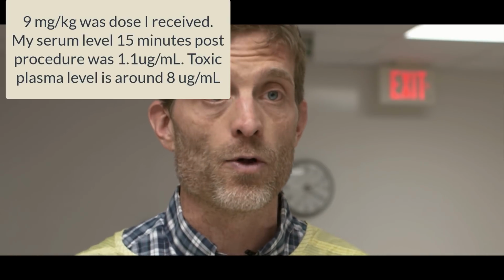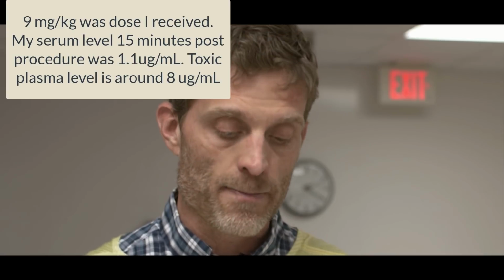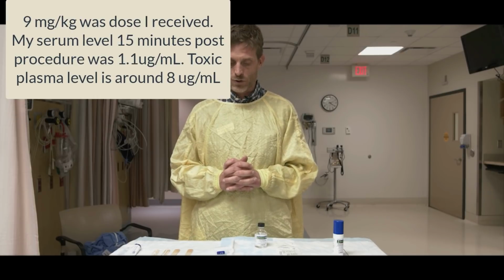But my total lidocaine dosing that day was actually, Chad was 4, I was in about the 9 milli, so more than double the per kilo dose than what Chad received today. And I was fine, symptomatically I was fine, but it'll be interesting to see what the levels show.